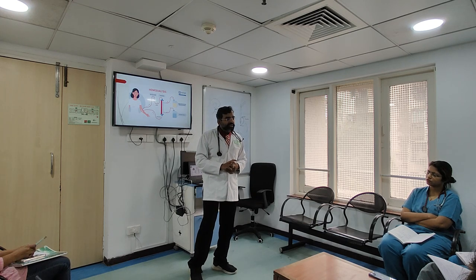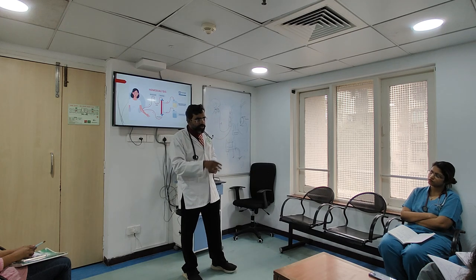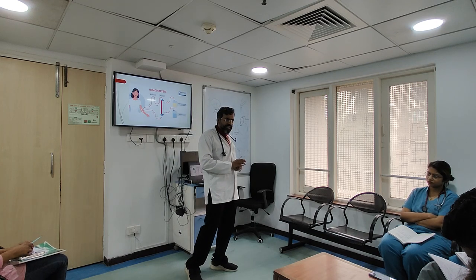So when you have CRRT, if you have a right-sided line, put a left-sided femoral line. That will make more sense, because otherwise you are not optimizing anything. You are just giving the antibiotic to the filter. Nothing more you are doing. Are you understanding? Clear on the access.